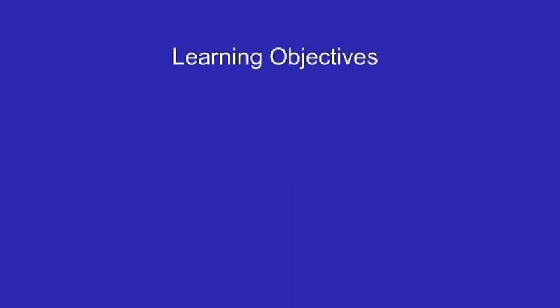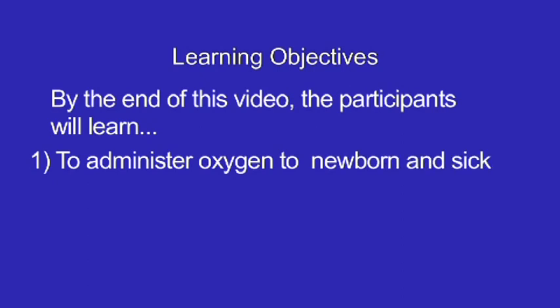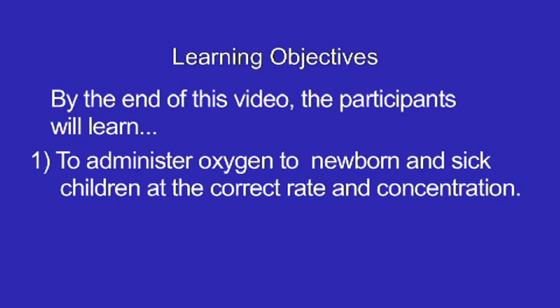Learning objectives. By the end of this video, the participants will learn to administer oxygen to newborn and sick children at the correct rate and concentration.